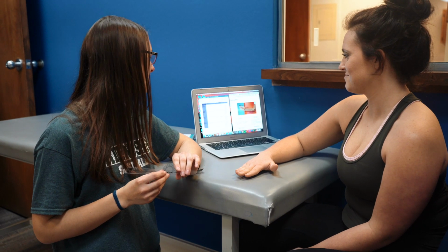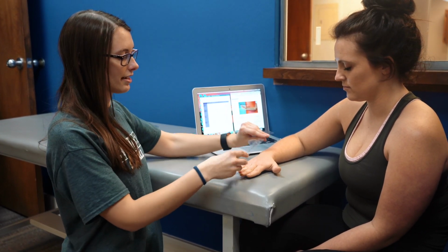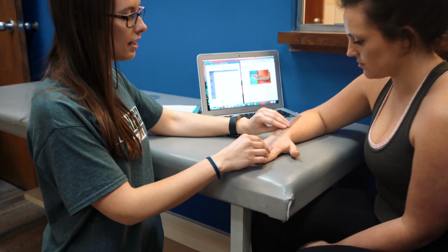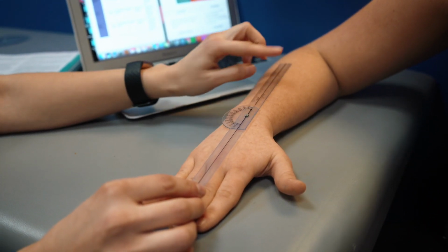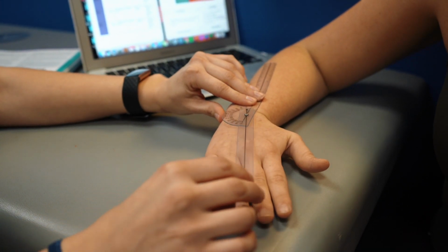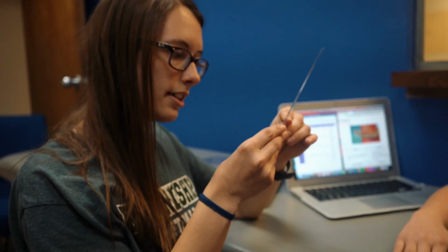We're going to do wrist radial deviation. So for this, make sure that the half sun is turned in the opposite direction of the way the wrist is moving. So we're going to align the center of the fulcrum up to the dorsal part of the wrist and the stationary arm over the forearm and the moving arm on the middle finger. So go ahead and deviate for me. All right. So she is at 25.